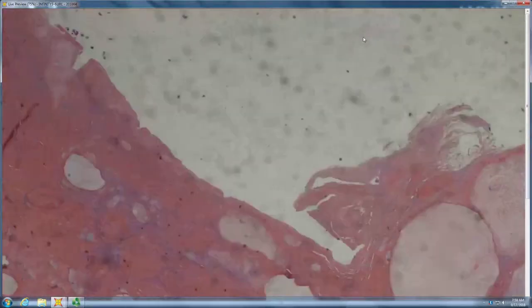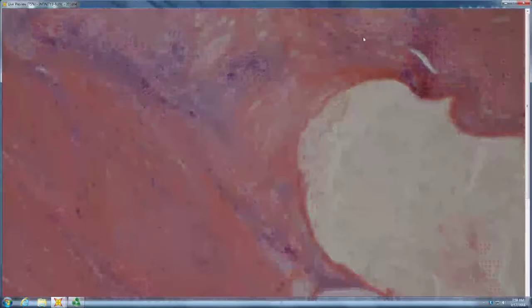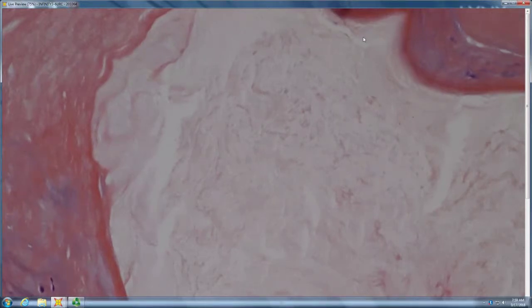Let's see what we got here. That's good. All right. So, little nodules of schmutz in the middle. I'm not sure if that's some sweat or something else. So what is it? You see it better up on the screen. Oh, okay. Are those crystals? Yeah. So, perhaps gout or some other crystal? Yeah. Which one is feathery like this? Gout. That's gout.